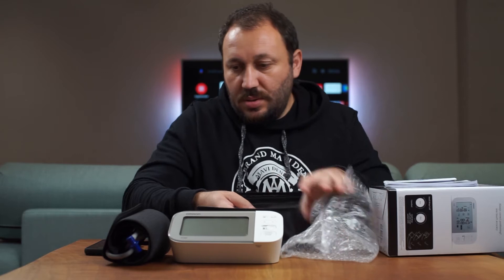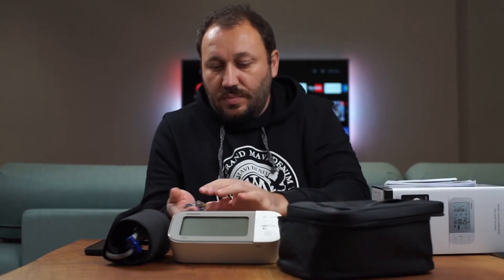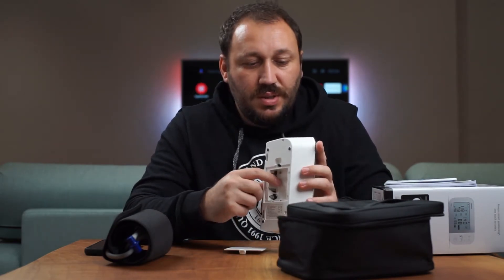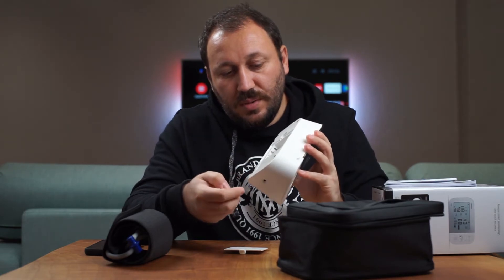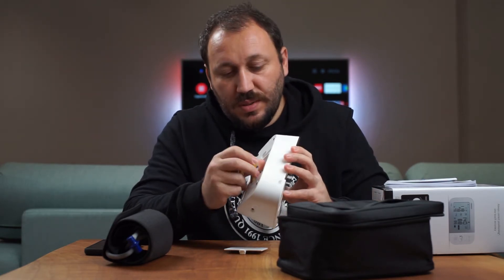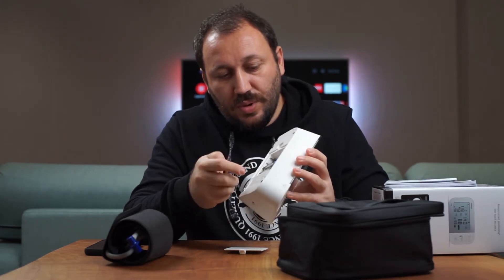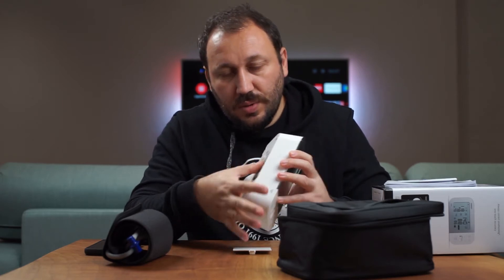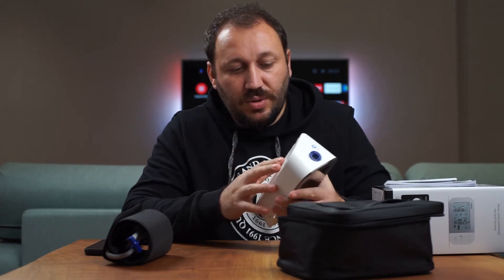Inside the carry bag you have the Omron X7 device, the upper arm attachment, and four AA batteries. This version works with both batteries and an adapter, but the adapter is sold separately. You can check the web page to see which adapter they advise. I'll be using batteries since the older Omron I have runs well on them.